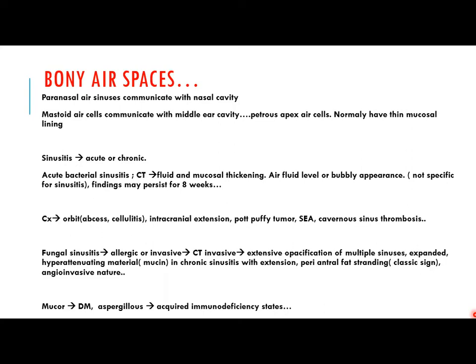So whenever we find these features, the thickening or fluid level or signs of acute sinusitis, it may not be the condition at the present time. The patient may have recovered from the sinusitis, but the findings will persist up to 8 weeks or more. So we have to take history, and we have to see the patient whenever we see cases of sinusitis findings.